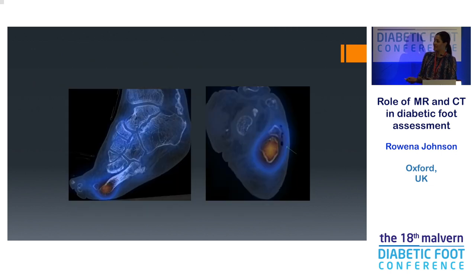This is an example at the head of the fifth metatarsal showing cortical destruction and remodelling, where the patient has a soft tissue ulcer and you can see increased activity — this is where the osteomyelitis is. And those darker parts next to it, because air is dark on CT and MRI, are little locules of air.